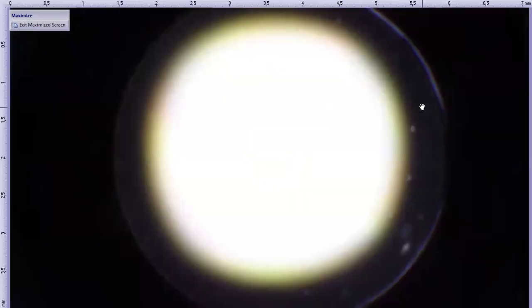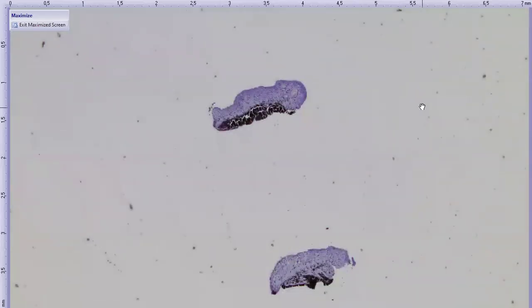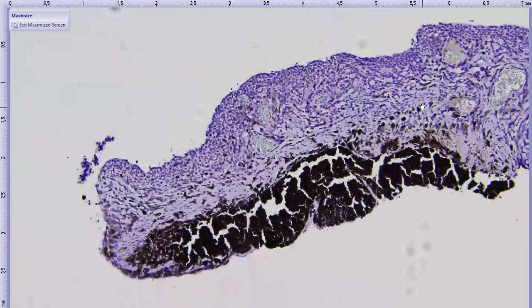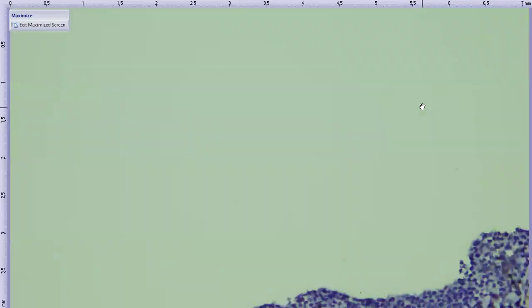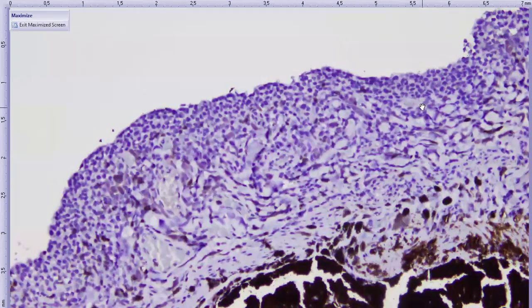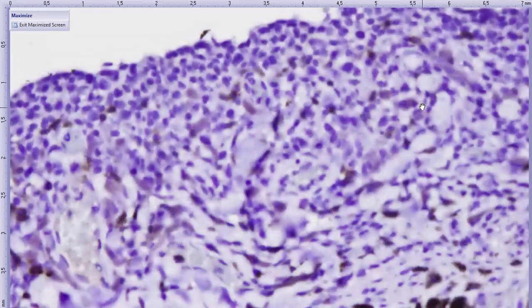Our CD3 immunohistochemistry here. I can find the iris biopsies. This one was back to a brown chromogen stain. You can see how all the melanin pigment still picks up pretty well in here. Ooh, sorry, small tissues are harder to navigate. That was as close as I could go. All right. Oh no, I can go one more.